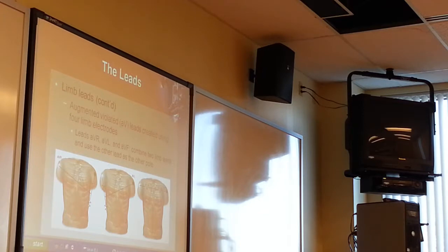Okay. So continuous monitoring, if you're not doing a 12 lead, you do it on the abdomen. If you're doing a 12 lead, you're doing it on the extremities. If you're using a LIFEPAK, their recommendation is on the limbs all the time.